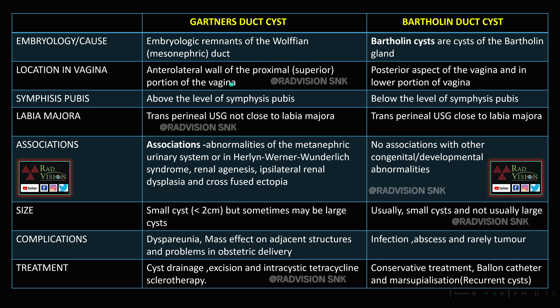Gartner duct cysts are typically located in the upper fornix of the vagina, in the anterolateral wall, whereas Bartholin duct cysts are located in the posterior aspect of the vagina in the lower portion. On coronal imaging, Gartner duct cysts are located above the level of the symphysis pubis, and Bartholin duct cysts are located below. On transperineal ultrasound, Gartner duct cysts are not closely related to the labia majora, whereas Bartholin duct cysts are closely related to the labia majora.